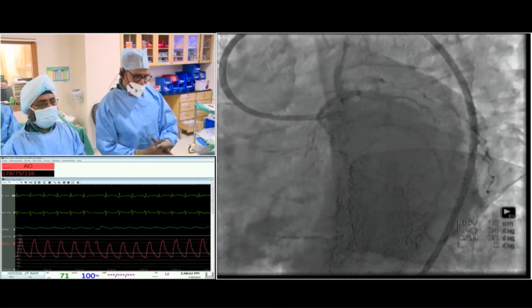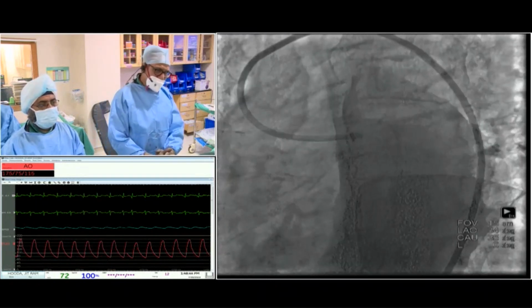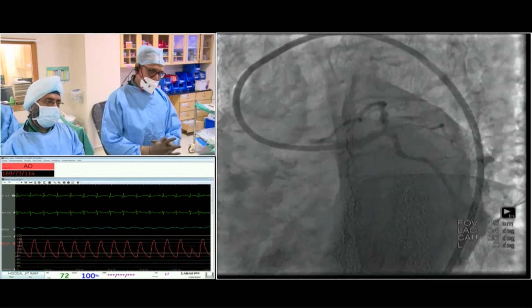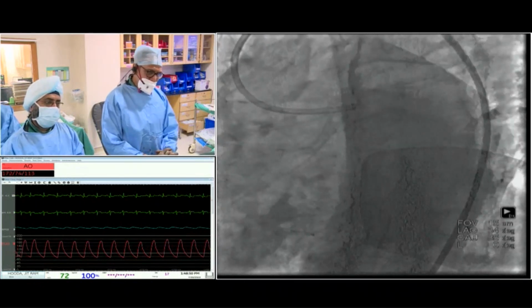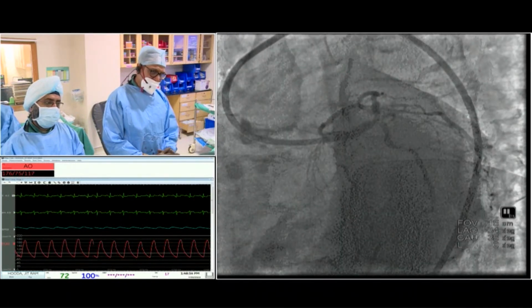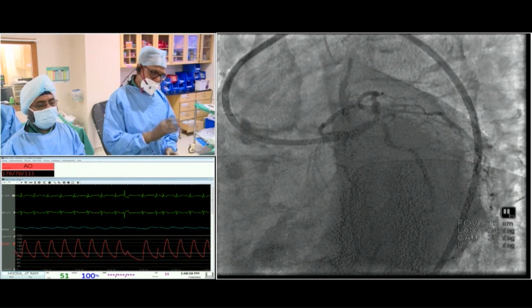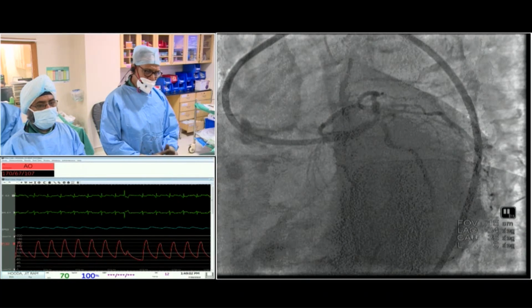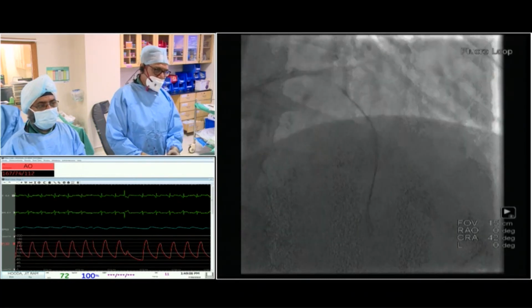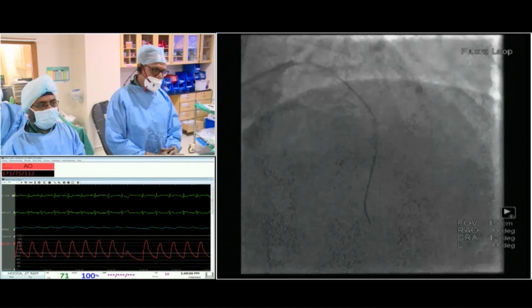So in this angiogram on spider view, we see that the distal left main has significant plaque. Nevertheless, we'll assess it by doing ultrasound. It also has proximal LAD disease, which is extending up to the mid LAD, as we see in the other view. And there's a large sizable ramus, which has proximal long disease. We checked some IVUS runs here.